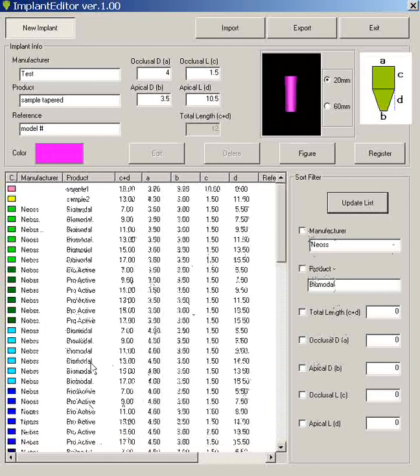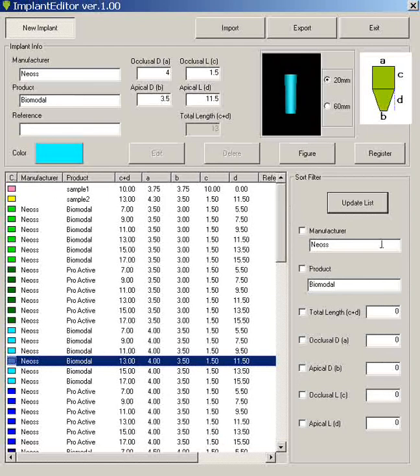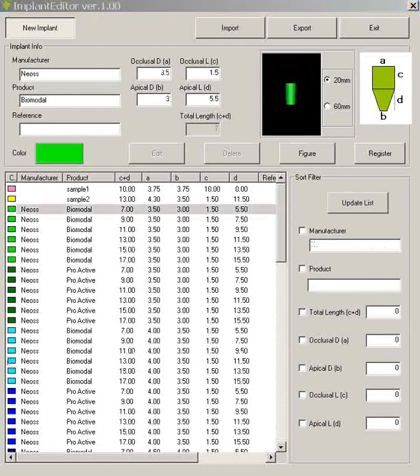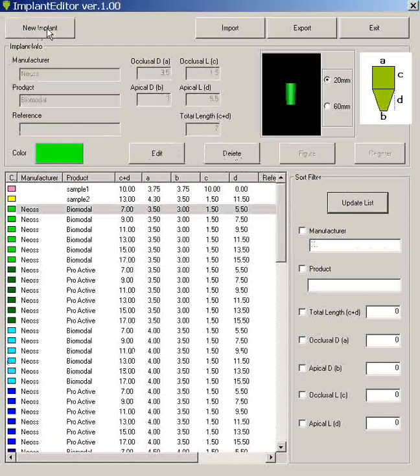Now any one of these could be deleted or you can edit. Now for edit and delete, notice they are grayed out. So if you wish to activate these, just make sure you're not a new implant anymore. Come out of that and now they become active.